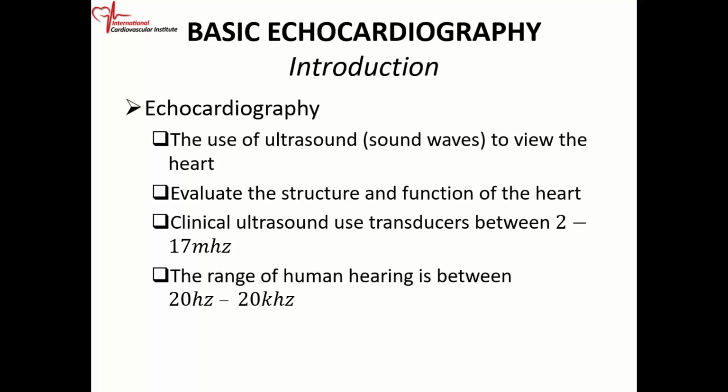So again, when we say echocardiography, it is the use of ultrasound to view the heart. Now, we look at not only the structure, what the heart looks like, but the function of the heart. We look at the circulation of blood in the heart. We look at the valves to make sure the valves are working properly.